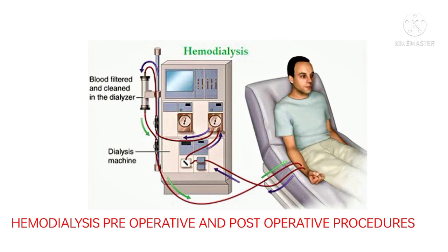Part preparation. Hemodialysis procedure. In hemodialysis, the client's toxin-laden blood is diverted into a dialyser, cleaned, and then returned to the client. While the blood is in the dialyser, a mechanical proportioning pump causes dialysis fluid to flow on the other side of the membrane. Toxins diffuse across the membrane from the blood to the dialysate. Strict asepsis must be maintained throughout the procedure.